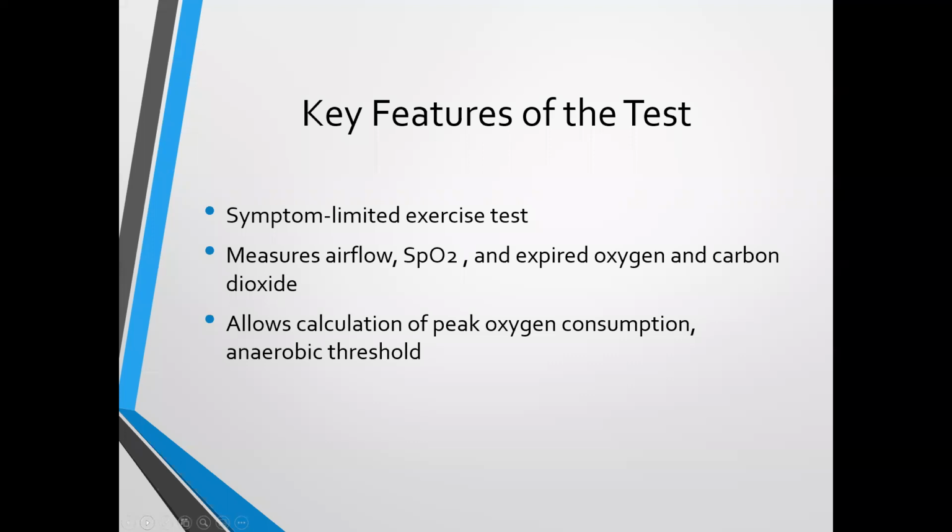Key feature of the test: it is a symptom limited exercise test. So, chest pain, or the patient may say, I can't keep up. So that's symptom limited. That's, I can't keep up. That's them telling you subjectively they can't.